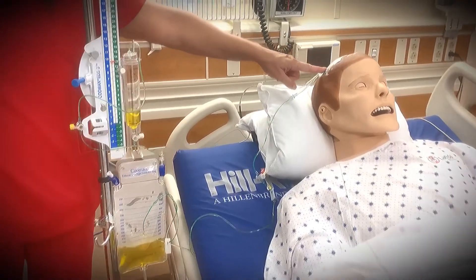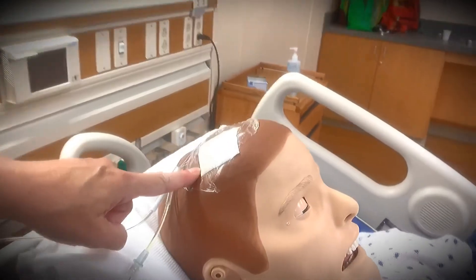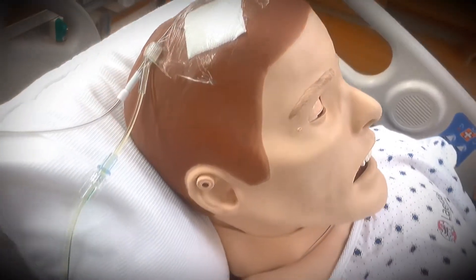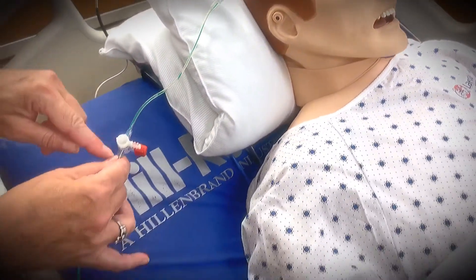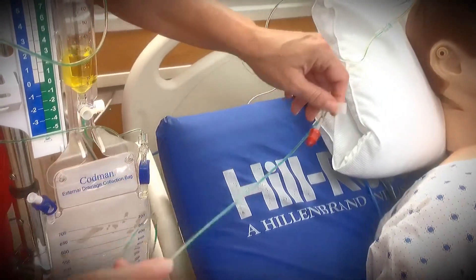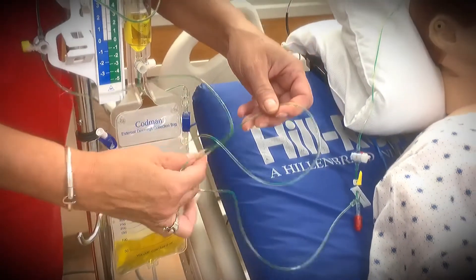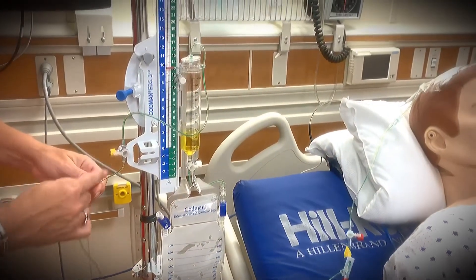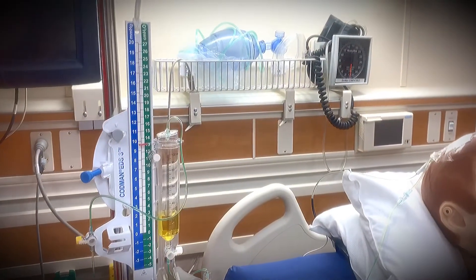I'm going to start my assessment by looking at the actual site dressing to determine if it is, in fact, clean, dry and intact — and yes, it is. Then I'm going to follow my tubing to make sure that the system is open: off to the atmosphere, unclamped, unclamped, off to the atmosphere — so still open to the drainage system.